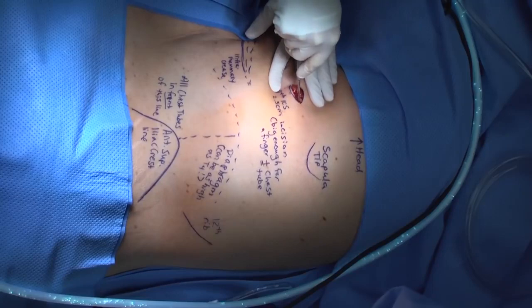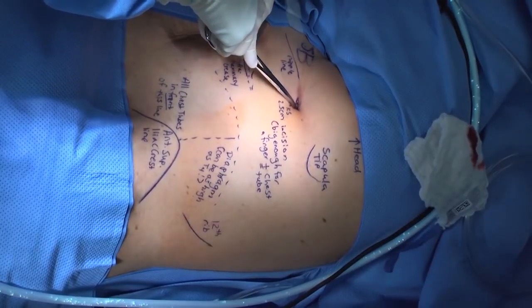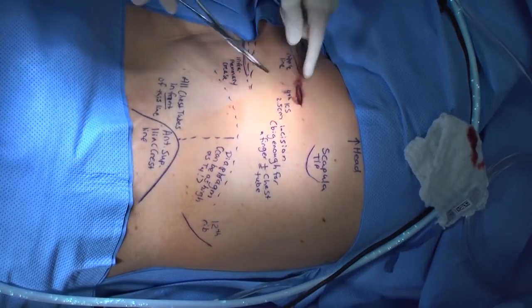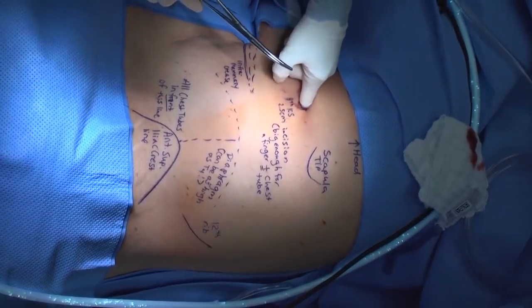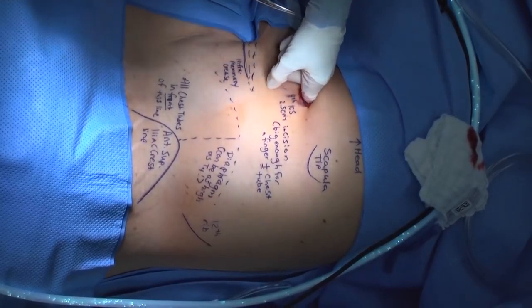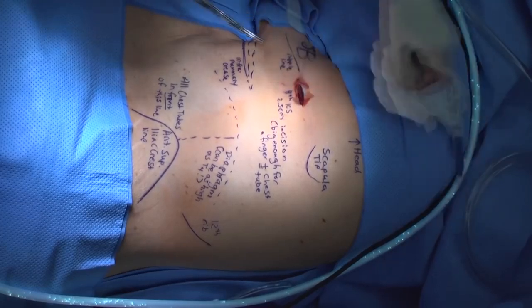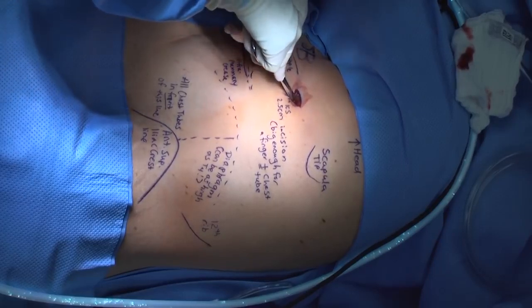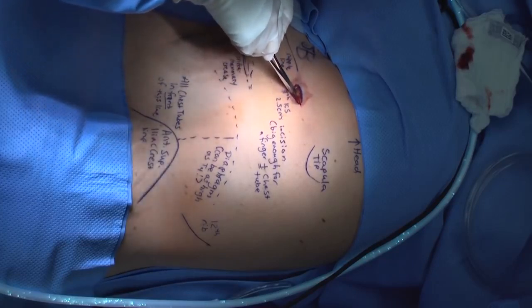Our incision is created. Blunt dissection is carried down to the chest wall. A finger can be used to help identify the top part of the rib. Remember that the intercostal artery, vein, and nerve run along the underside of the rib, and injury to these vessels can result in a significant amount of bleeding. The chest should be entered bluntly with a hemostat or curved Kelly clamp, or even your finger. Brace your dominant hand with your second hand to avoid advancing the clamp too far into the chest, risking injury to the lung or even the heart on the left side.